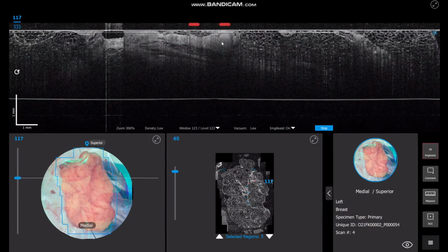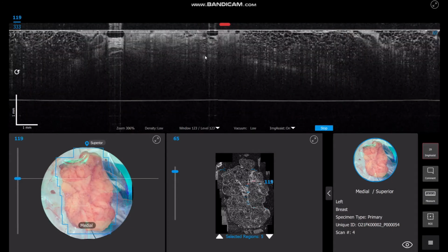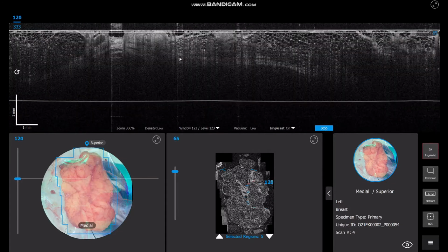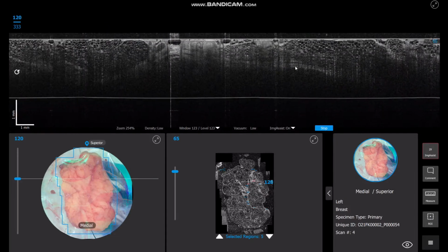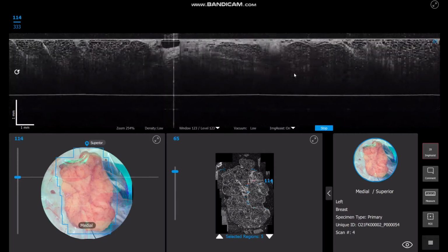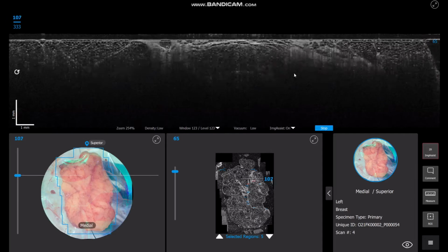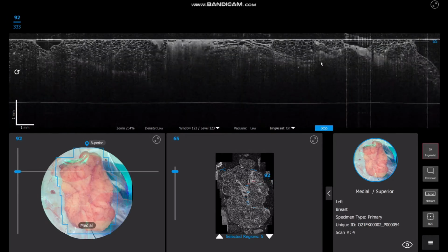Okay, and you can see that by comparing what's at the top, beautiful targets there, you can see that the DCIS really is at the margin. And it's on a number of these thumbnails. And now that we're scanning across, you can see it's really a number of places quite close to each other on that main specimen. And as we scan up, you can see that we're looking across more and more of this image. It's actually quite normal just here. There are none of these little red bars to highlight things.